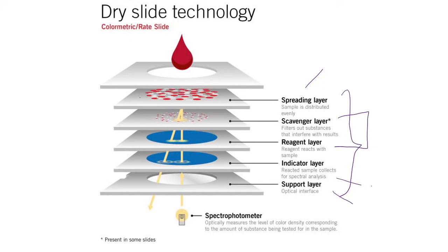And then as mentioned, you just give time after adding your sample, just give time for it to really proceed the whole process, and then spectro na dayon ang last. Dinhi nato na siya i-read. Okay, diba? As you all know, spectrophotometer, color development man jud na, mga colors man jud na ang iyahang gina-read, which is also what is being done here in your dry slide technology, color development.